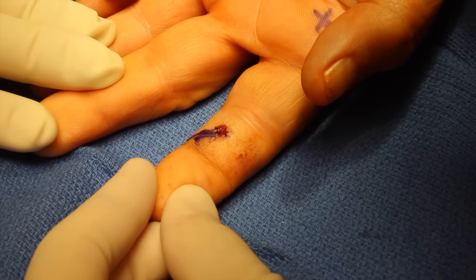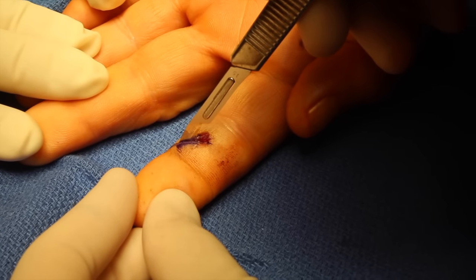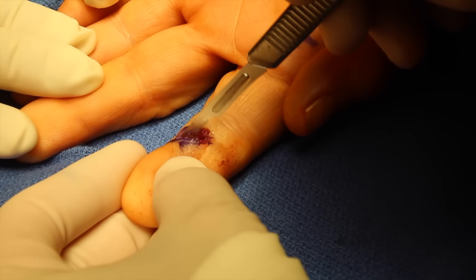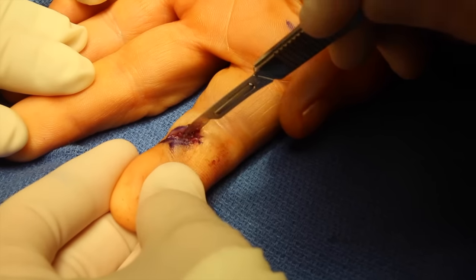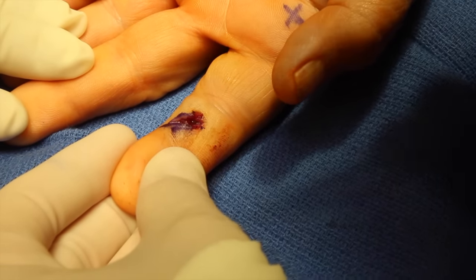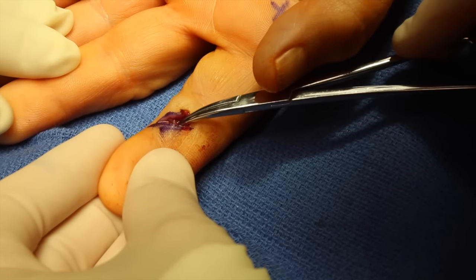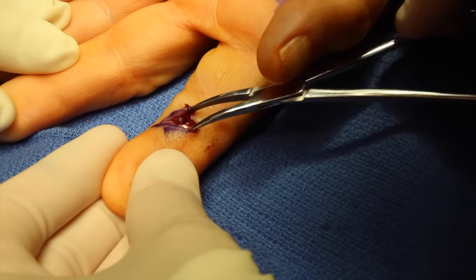I start by making an oblique incision across the finger, and I do this in case I have to extend Bruner's incision to find it down in the flexor tendon apparatus. However, I'm easily able to see it with a simple spread of the hemostat, and you can start to see the sheen of the BB in the picture.